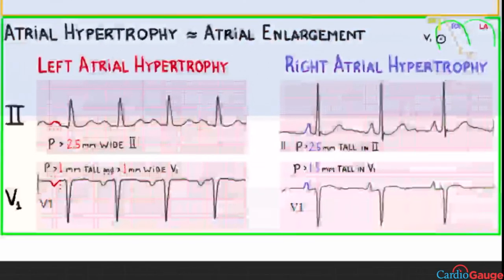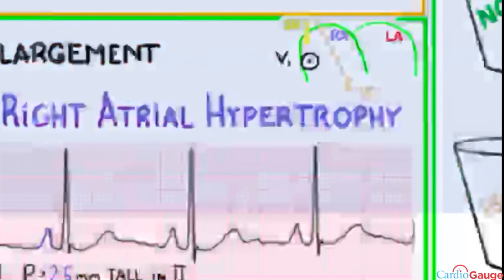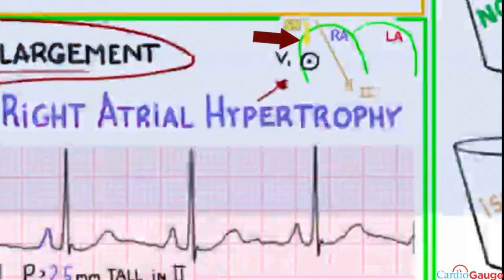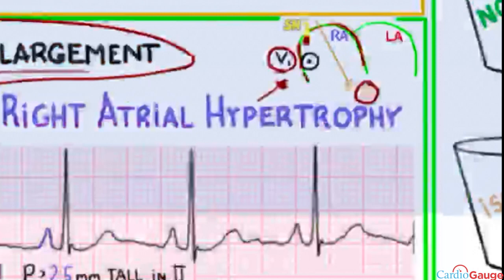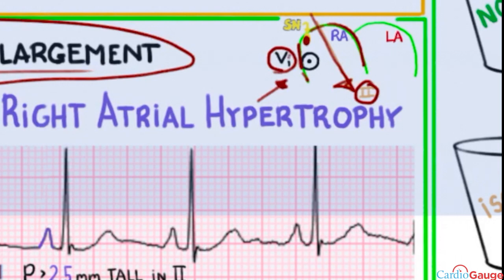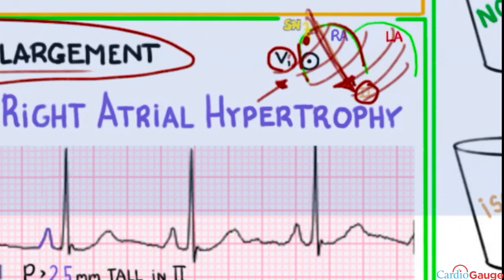Moving on to atrial hypertrophy, which is the same thing as atrial enlargement. The sinus node is at the top right side of the right atrium. The best leads to look at the atria are lead 2 and V1. Lead 2 shows 60 degrees, which is pretty much the whole direction that the atria depolarizes. V1 sits right over the right atrium, and since the sinus node is in the back of the right atrium, depolarization moves toward V1, making it a great lead for atrial depolarization.